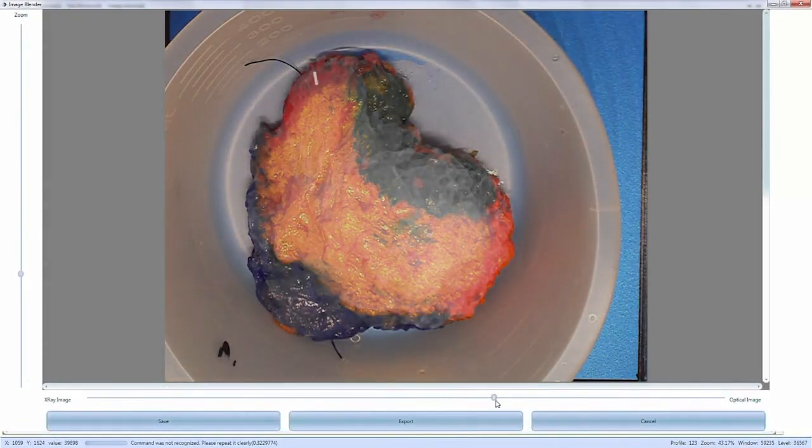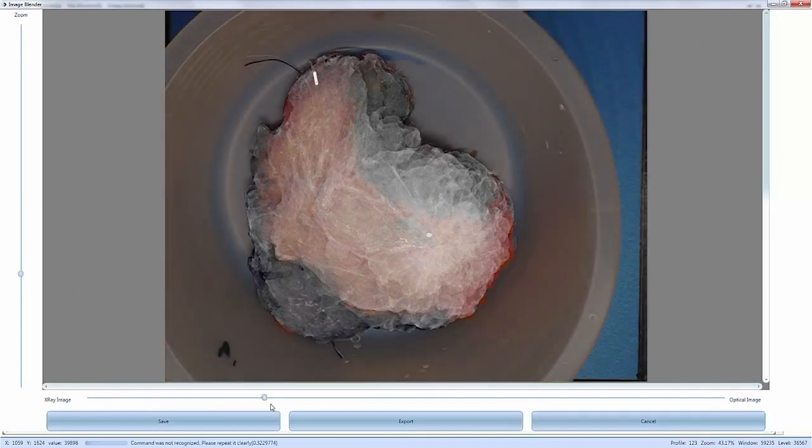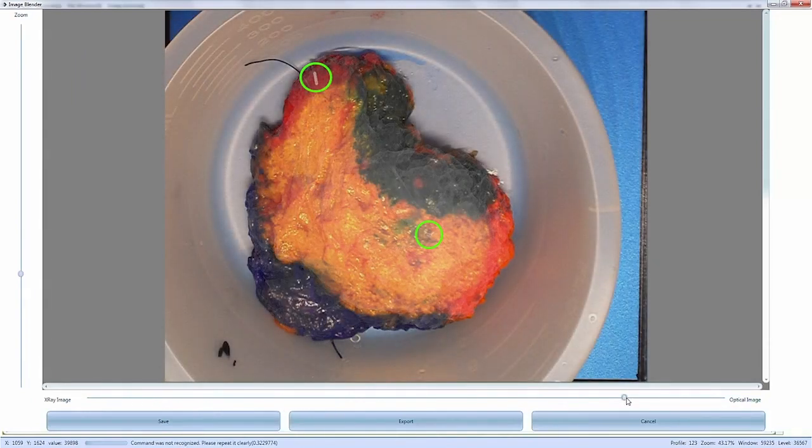The optical camera enables the use of the proprietary image blender. Using this unique tool, the operator can view the specimen as an X-ray image, as an optical image, or any combination in between. This enables the operator to easily, quickly, and accurately identify the exact location of clips and microcalcifications on the physical specimen itself, saving time and improving OR workflow.